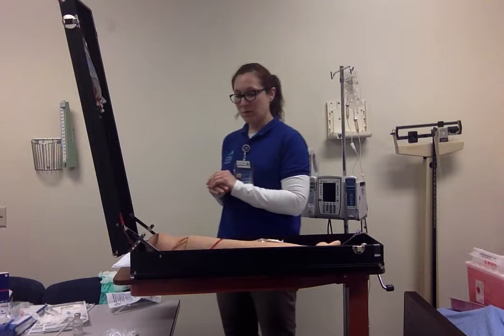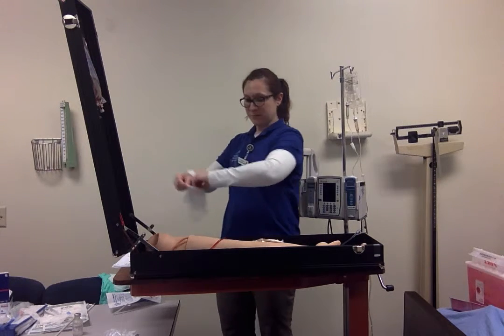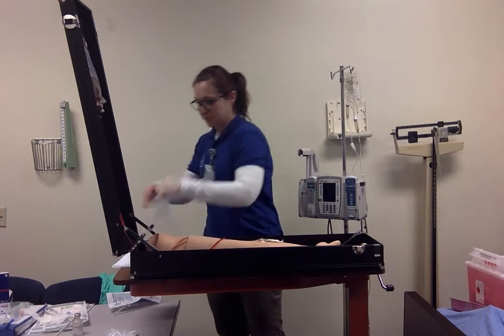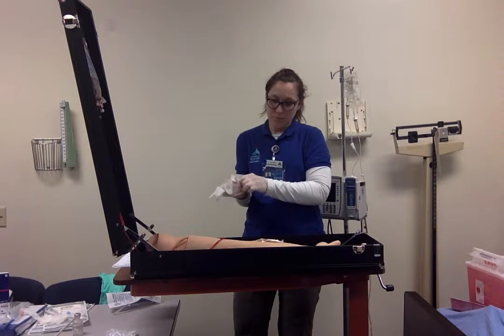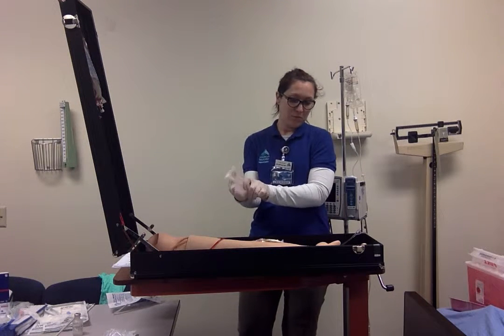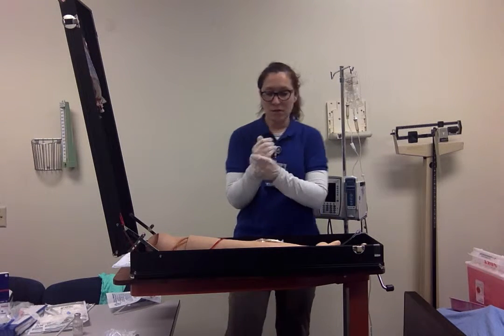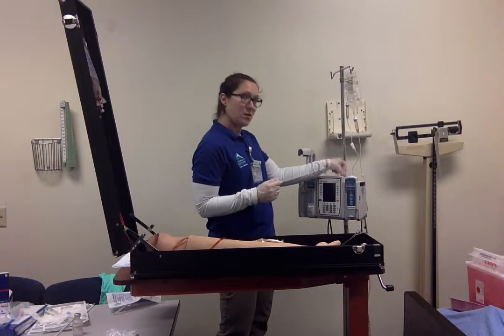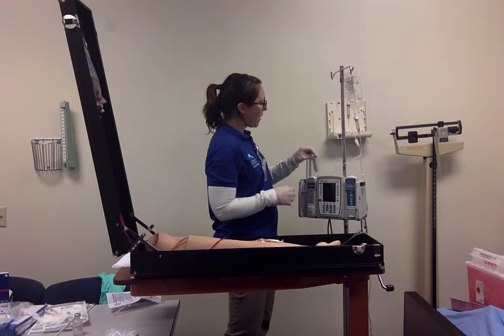Okay. Next, I want to wash my hands again, and I'm going to put on some clean gloves. All right, once the clean gloves are on, I'm going to go ahead and get ready to set up the piggyback.